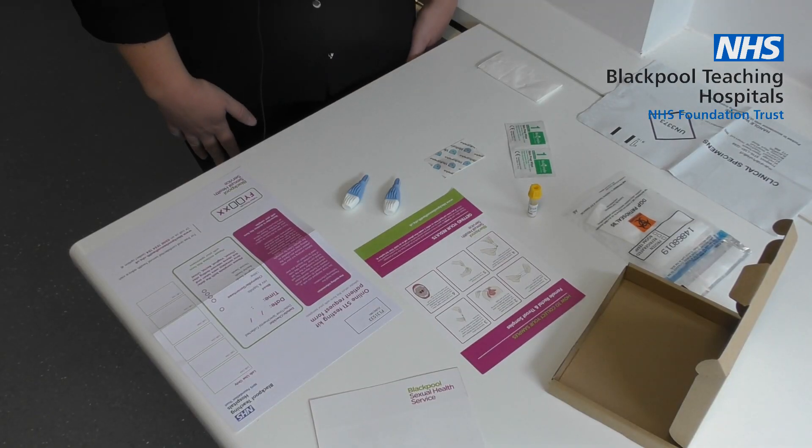Find a clean flat surface to lay your test kit out on. If you can, and if you feel that you are able to, stay standing up and keep your hand below your waist where possible to help blood flow.